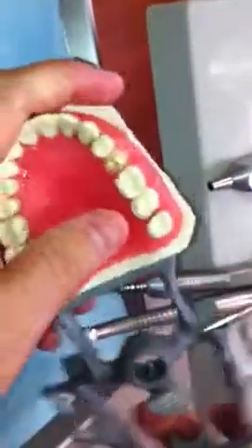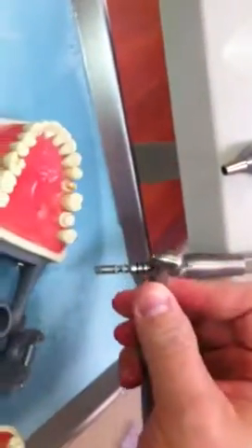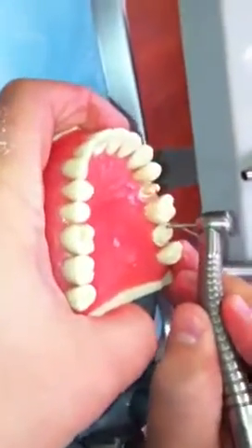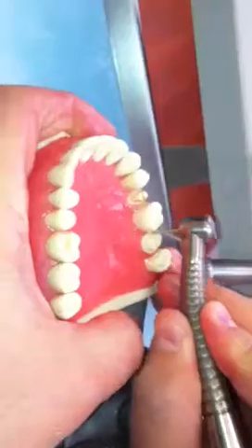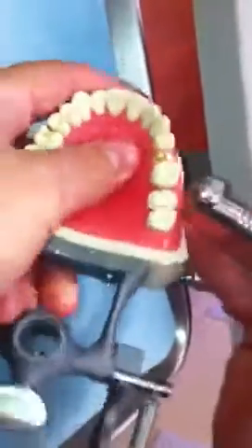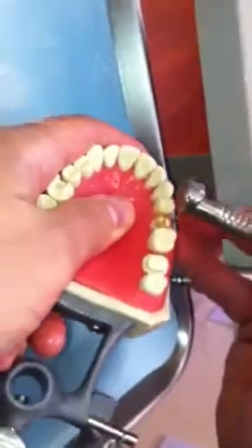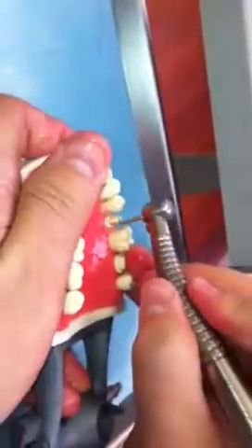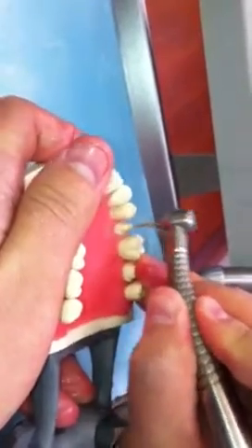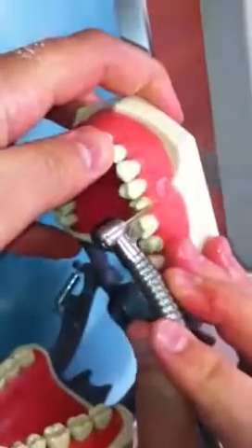I've done like a thousand preps already, but practice makes perfect. Do a bunch of these. Turning a feather edge or a chamfer into a shoulder should be no problem. Just use the right burr, hold the burr at the right angle, and cut into the tooth. No problems, no worries. Just cleaning this up because I'm anal retentive.